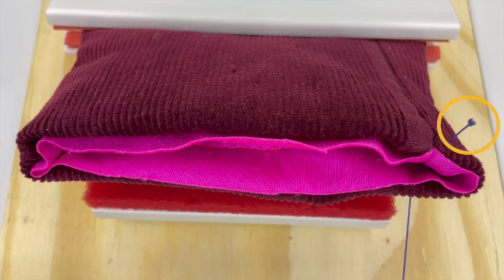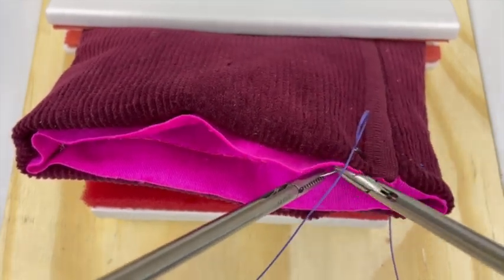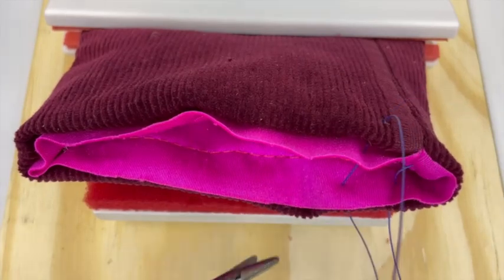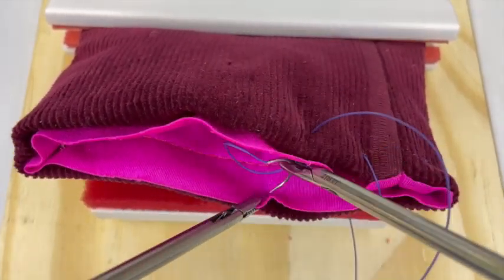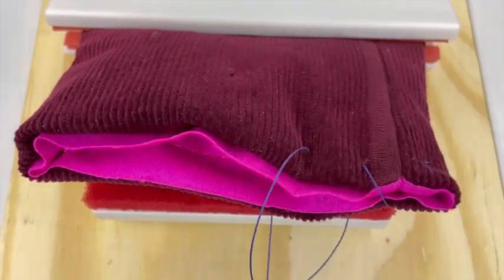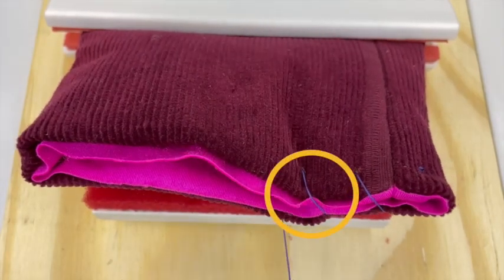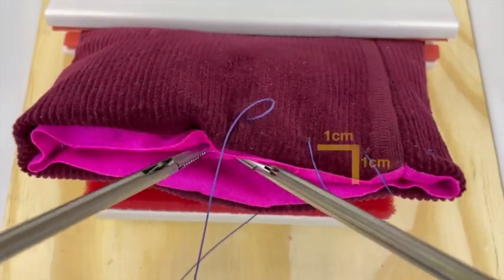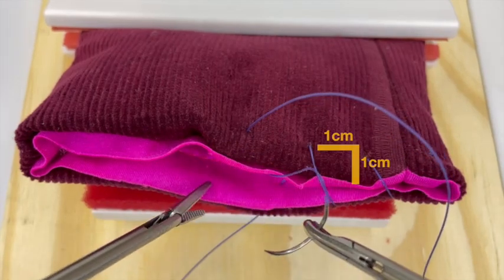The knot simulates the loop on the end of a unidirectional barbed suture. Continue these steps along the entire length of the vaginal cuff. After each anterior and posterior bite, it is important to place traction on the suture to ensure a tight closure of the cuff. Aim to space the bites approximately one centimeter apart and one centimeter behind the cut edge of the vagina.